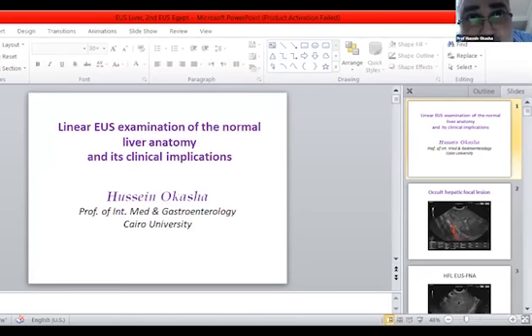It has a margin. The fallacies of endoscopic ultrasound in visualizing hepatic focal lesions are usually due to location, and not the size or texture of the lesion. If it is located in segments 5 or 6, it is difficult to visualize. If you carefully and thoroughly persist, you may visualize it, but really it is a very difficult segment.